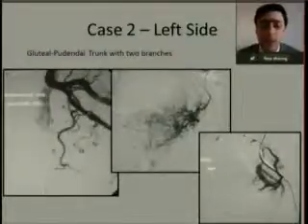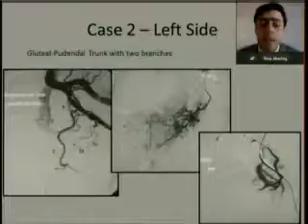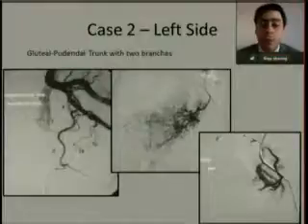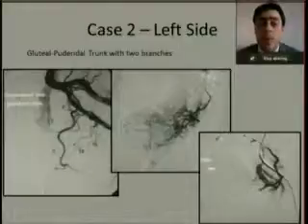So here again, a better picture on your left-hand side. You see number one is the prostatic artery, and 1A and 1B are respectively the anterior or cranial prostatic artery, and B is the posterolateral prostatic artery. And you see in the middle, you see selective angiogram with almost complete opacification of the prostate, and on your right-hand side, the control post-embolization with occlusion of the prostatic arteries on its side.